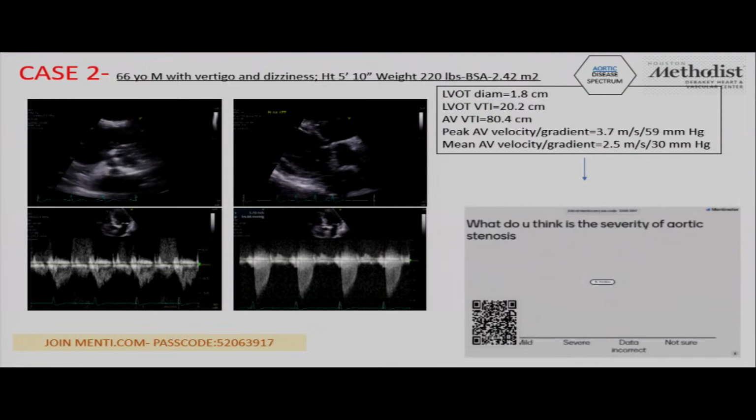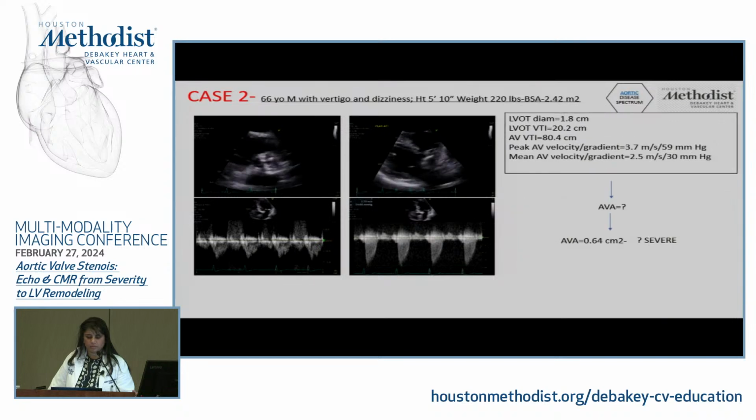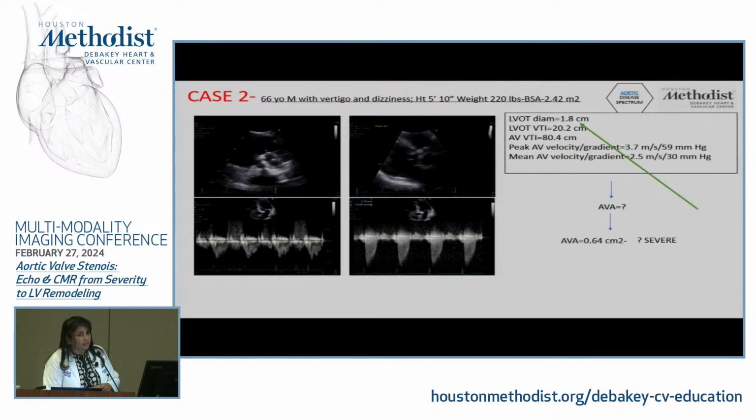I'm sure most of you have chosen the right answer. Well, let me give you the valve area: it is 0.6. Right? Any of the fellows or sonographers, what do you think? Is it really severe? What do you think is the problem here?